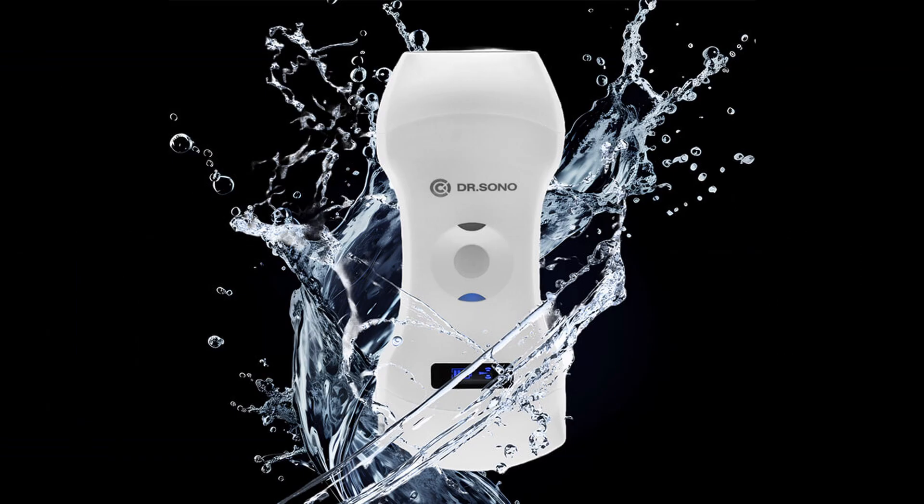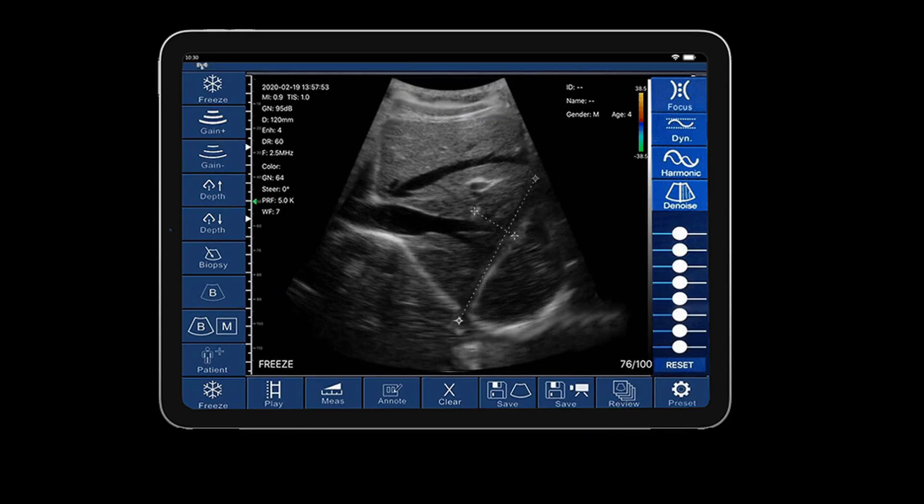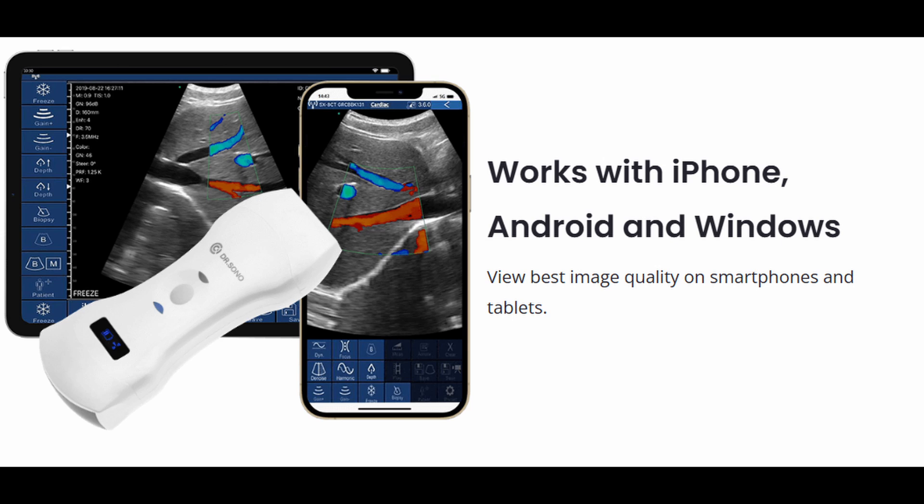Finally, we have the Dr. Sono TriScan Max — the budget-friendly option. This one's for the financially conscious among us, the ones who prefer their money in their pockets. It's a bit like the Jack of All Trades: it has three scan modes and works with almost every operating system. It's like that reliable friend you can always count on, even if they don't have all the fancy bells and whistles. It does the job and doesn't break the bank.